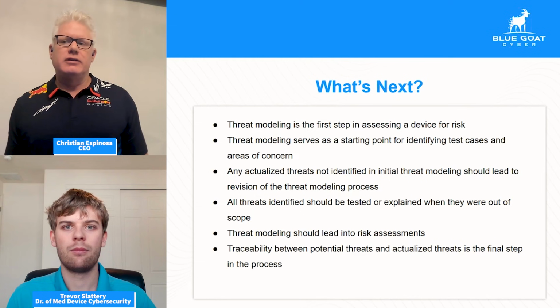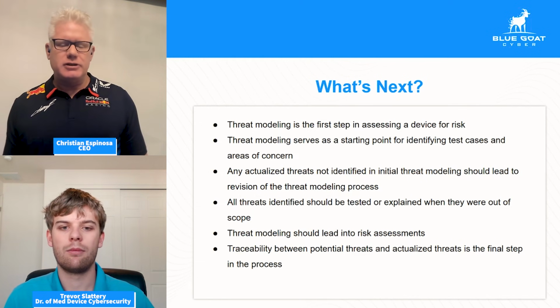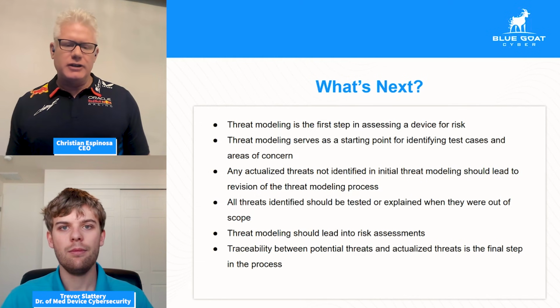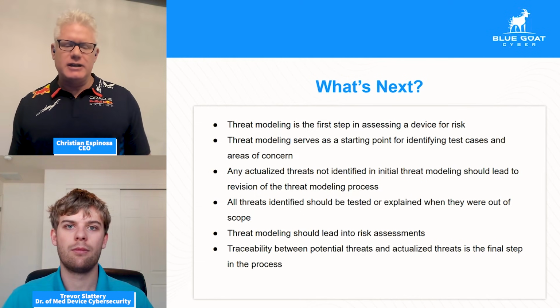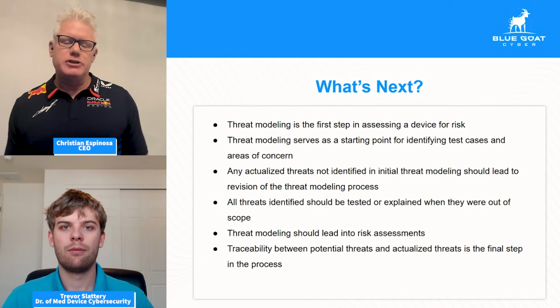So this is a lot of education and awareness. Unfortunately, like I think we mentioned on a podcast or something, most software developers don't understand cybersecurity. And like you kind of talked about, their purpose is to build something that works. Our purpose with these test cases, as you mentioned, is to try to get some unexpected or weird behavior out of the device that it wasn't designed for in order to realize something nefarious. That's the lens we look at, versus the software developers just trying to add the functionality and get, like you said, the minimum viable product complete as well.